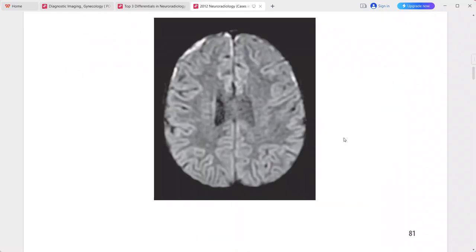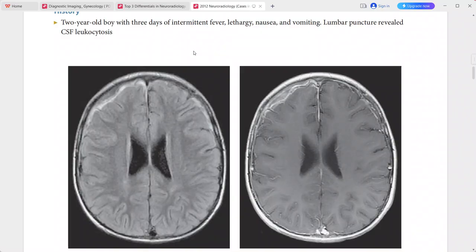On DWI the contents of the collection are hyperintense, consistent with restricted diffusion. This is a case of subdural empyema. Differentials include epidural abscess, subdural effusion, and subacute or chronic subdural hematoma.